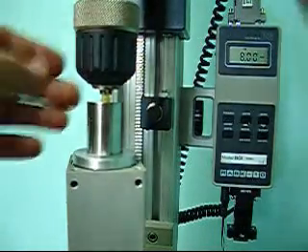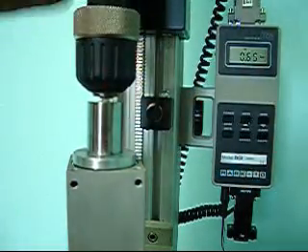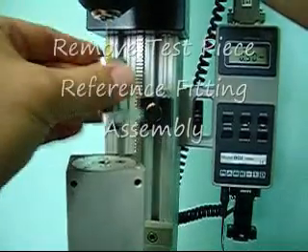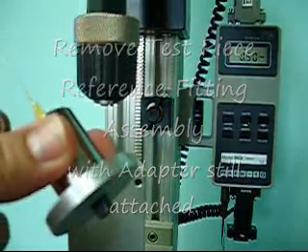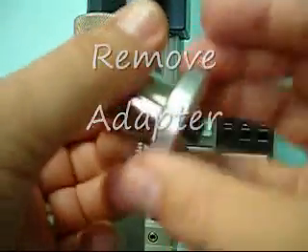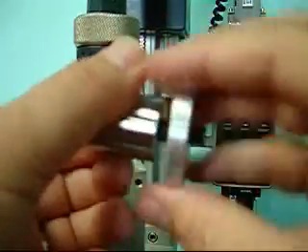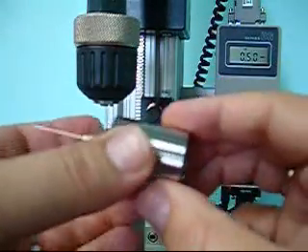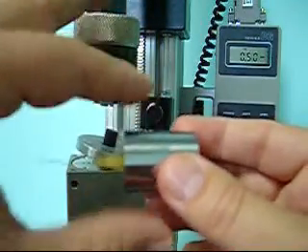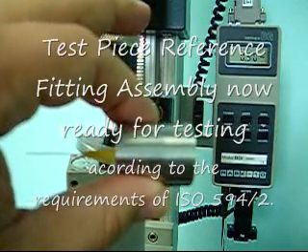I now loosen up the chuck so that it has released the needle, and I pull it forward. I take this piece right out — the whole piece comes together. Take it right out. Disconnect the adapter. And now I have an assembled test piece attached to a reference fitting that I can use for the next level of testing, as the standard requires.